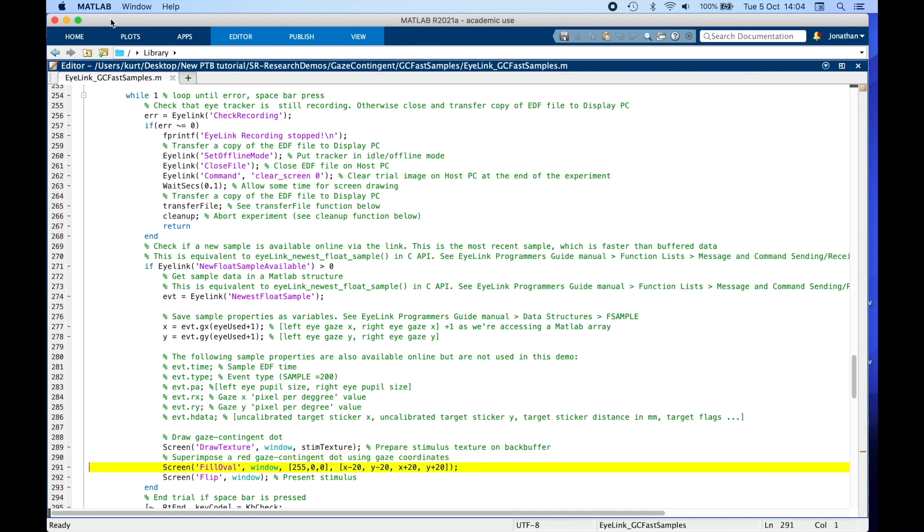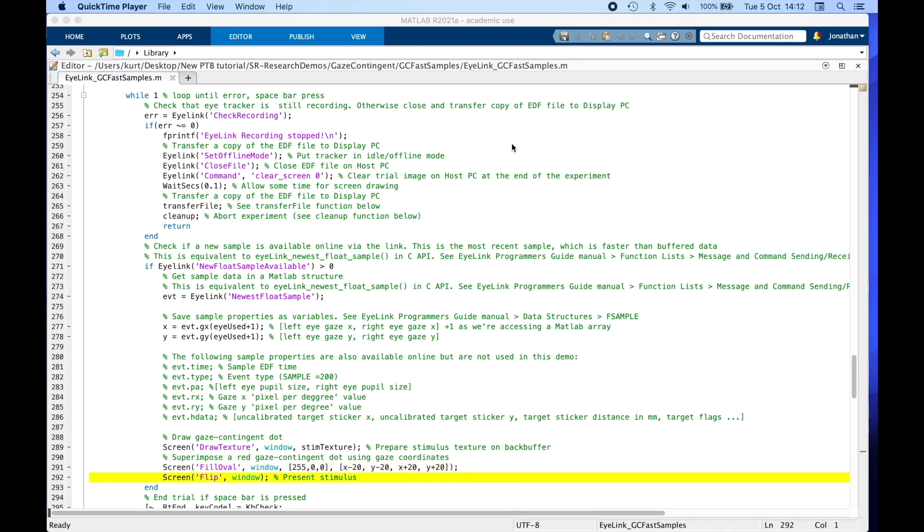Then we create a gaze contingent red dot on the screen by drawing an ellipse with a 20 pixel radius around the retrieved X, Y gaze position. We flip the screen at the next retrace before moving on to the next iteration of the while loop.